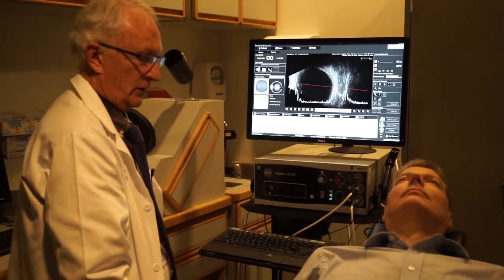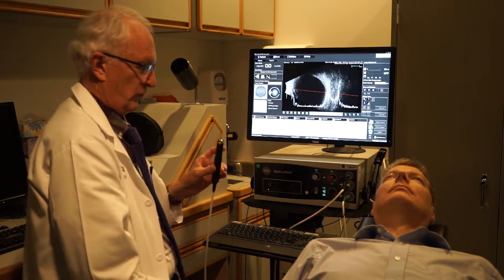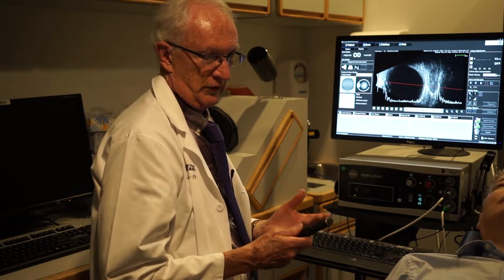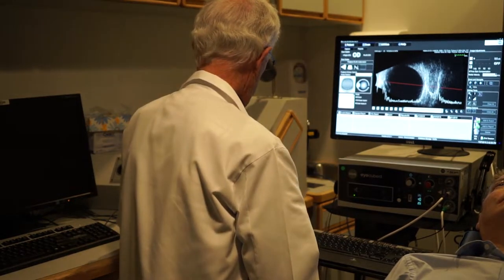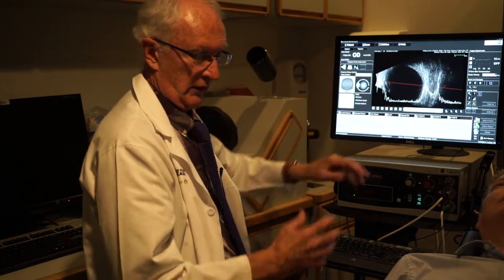I'll now demonstrate the immersion technique where we show the front of the eye. We can use both the standard 10 megahertz probe or high frequency probes called UBM, or ultrasound biomicroscopy, which go from 40 up to 60 megahertz — this machine has a 40. To do this, we have to stand the probe away from the eye because of that initial signal where information is lost, so we back off the probe to see that part of the eye.